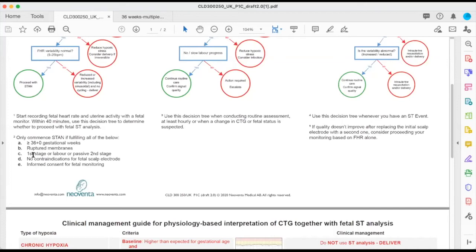It's about establishing the baseline, isn't it? And so the baby's under stress in the active second stage. Yes. So it's the knowledge that we are taking the baby as its benchmark for itself. So when you're trying to establish a benchmark or a baseline, you need to make sure that this baby is in a stable state. Not in a state of change.